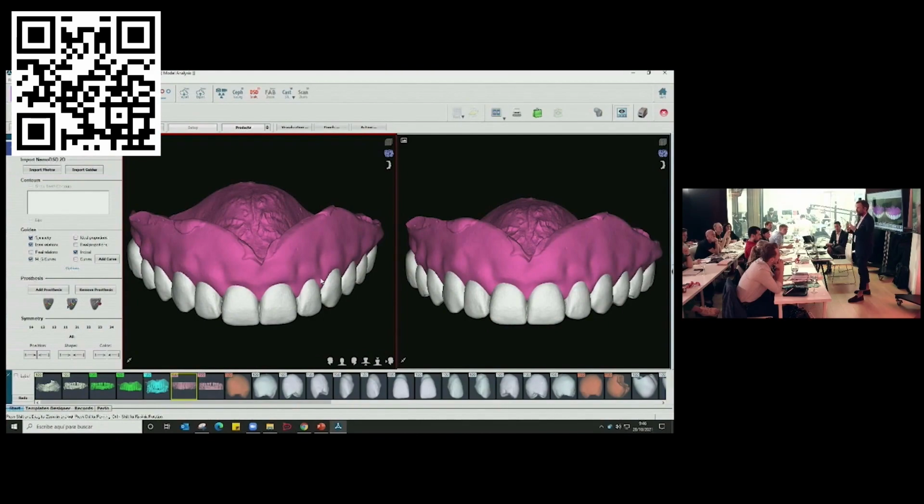Some patients show a lot of the lower teeth, and it's something that bothers them a lot, so we can do the mock-up. In her case, I would do a normal conventional mock-up over the teeth, if that was the case, okay? So transfer this with Bisacryl. So we have to bring the design from the lower, adapt it so you are able to transfer it to her mouth, and then you can place it and test drive. Okay?